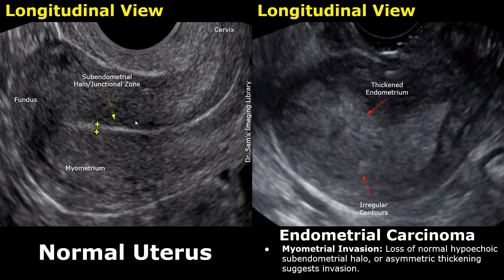The subendometrial halo is this thin hypoechoic layer surrounding the endometrium, representing the innermost part of the myometrium known as the junctional zone. Loss of this normal hypoechoic subendometrial halo indicates myometrial invasion. Here, we do not see the hypoechoic halo as it has been disrupted by the mass, which has irregular contours and a heterogeneous appearance.